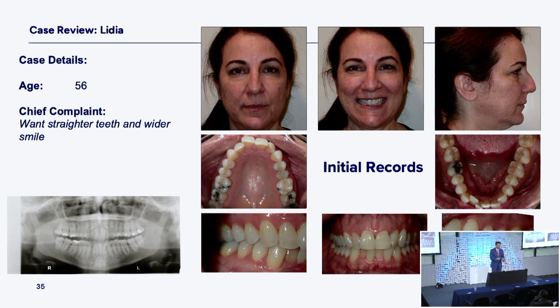And we recognize, again, arch form. We would measure the arch width. We would look at the inclination. The back teeth are leaning in. The lower are leaning in. The top are leaning in. Her smile photograph has 8 and 9 prominent. Her smile at the top center, 8 and 9 stand out. The rest of her teeth look kind of little. Her lip line is perfect. The empty buccal corridor is there to see.